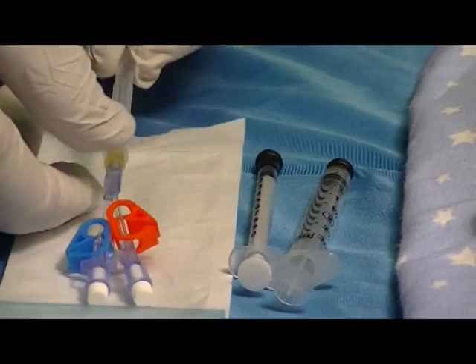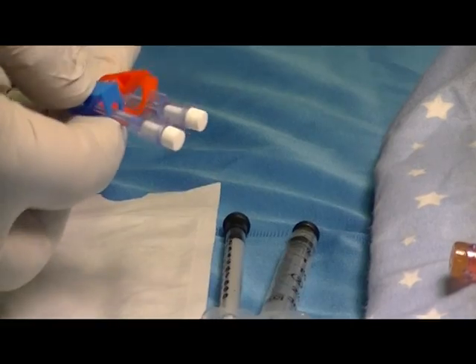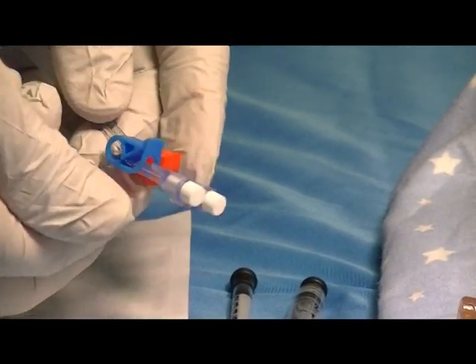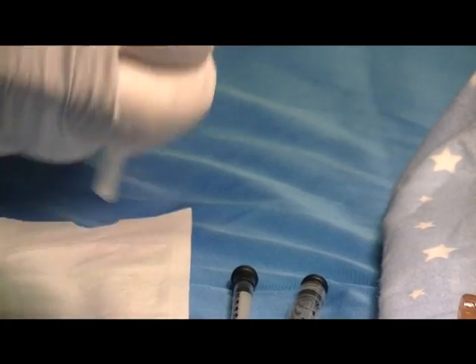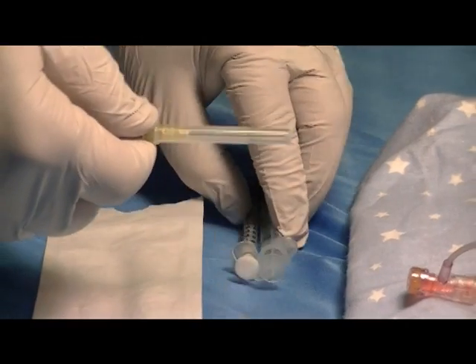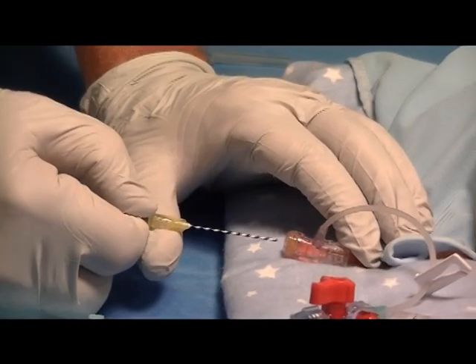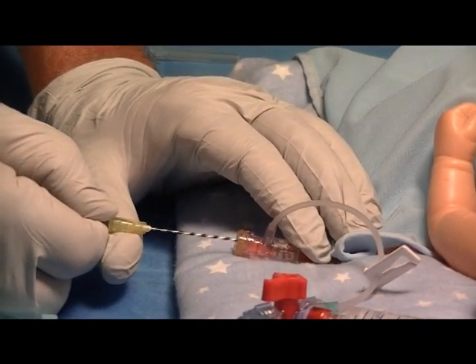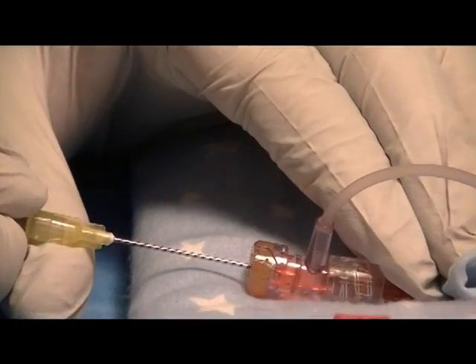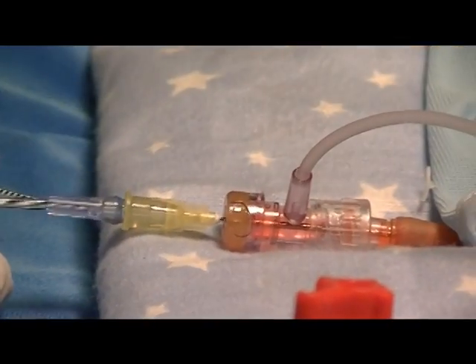At that point, clamp both the blue clamp and the red clamp onto the lines. Then go to the T connector, remove the sterility cover, and insert the Humi Microdraw blunt tube into the T connector until it seats fully inside the catheter hub.